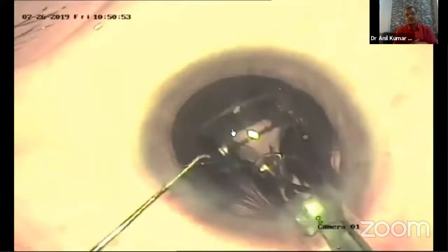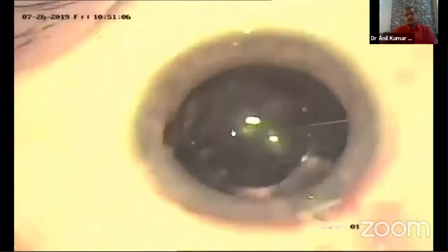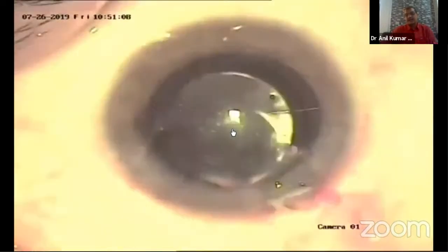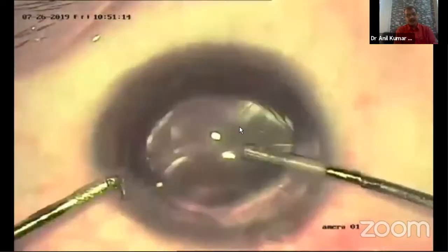So when we are injecting the IOL, we have to be very careful, because there should not be more vibrations on the side lines, main lines, or the lines of the RK, and those keratectomy lines can dehisce, and then sometimes we need to put sutures there. So that's why I'll be closing it. This is nearly very easy to perform, but it requires taking care of those line dehiscence and the calculation of the IOL power, ma'am.